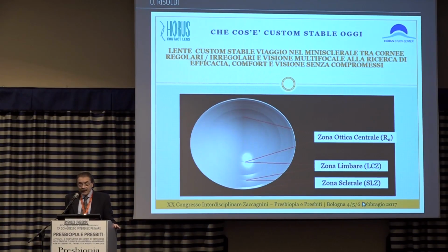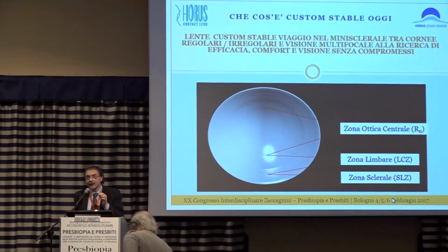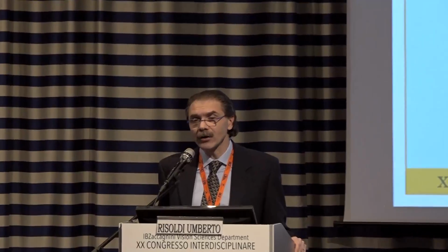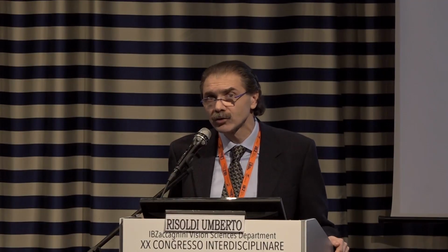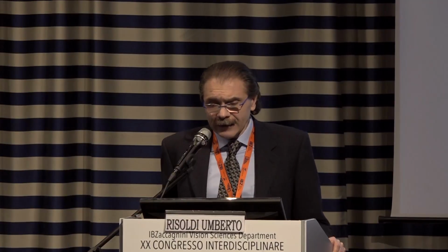We've selected our base radius. Now we have to decide about the sagittal height. We can do this through the limbal zone. We can move in steps of 50 microns, either upwards or downwards. And once you have established which is the best sagittal height, you have to avoid infiltrations under the lens, or at least allow for very few of them.